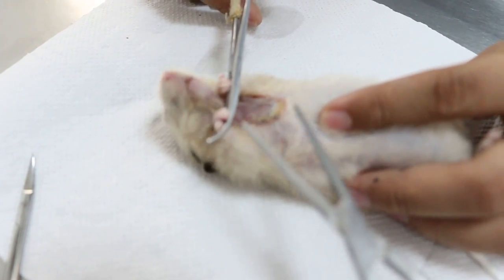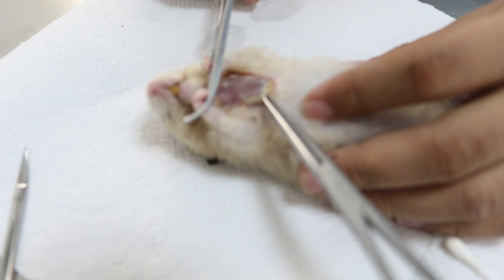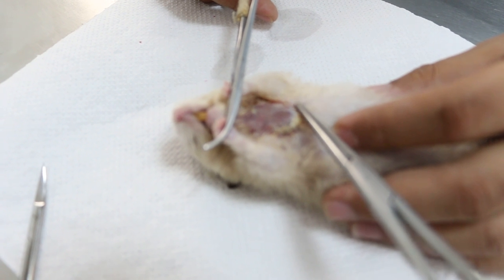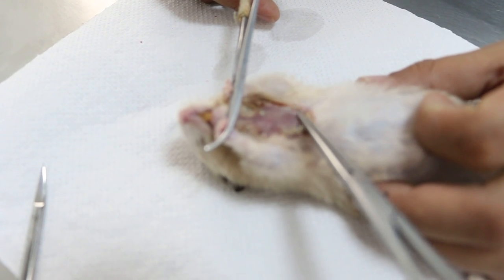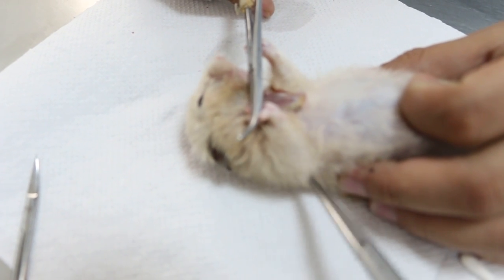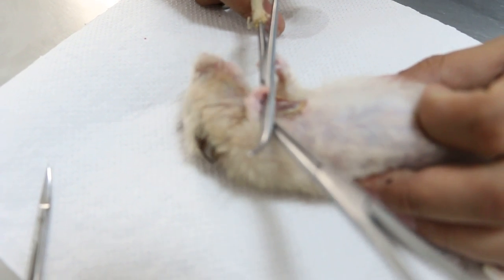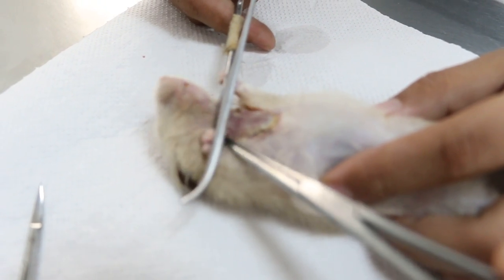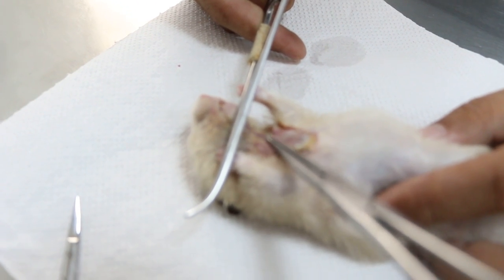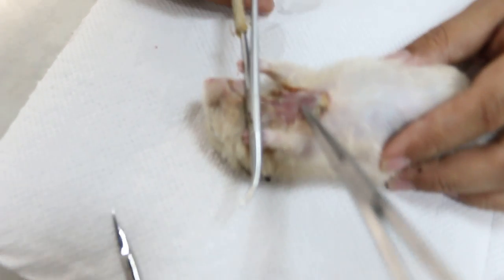From what I see, after removal of the third stitch, what you would have to do early on after removal of the neck tumour is: open up here or here and then just stitch up a bit here. At this angle, you stitch up — you open the Z and then stitch up a bit here, this part a bit, and this corner a bit. That means you still have a big hole, but this hole will be half the size and will heal by granulation.